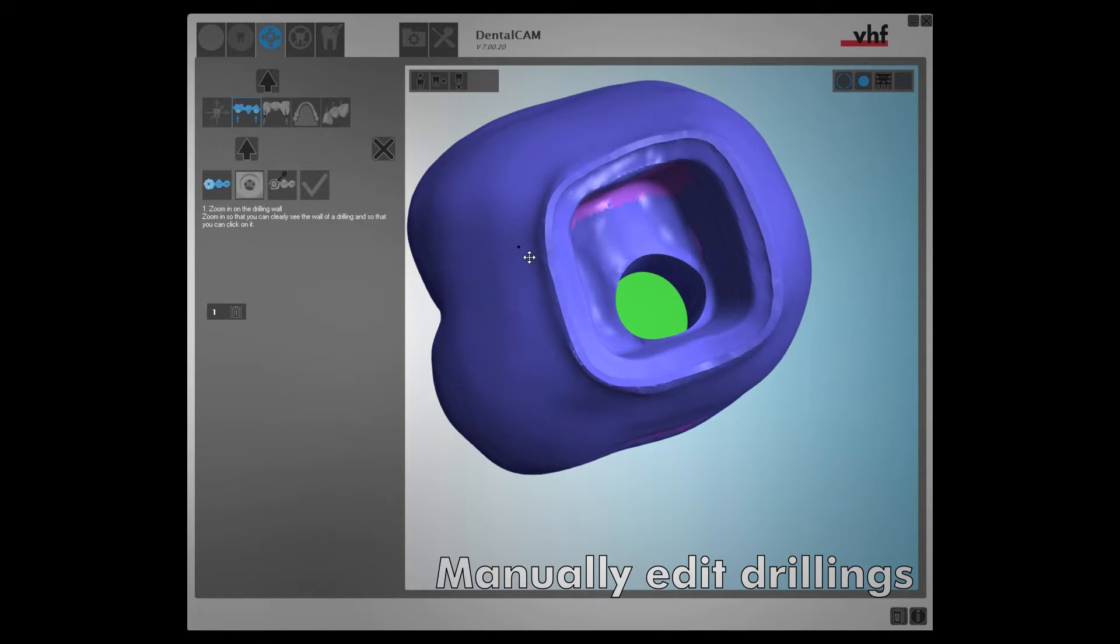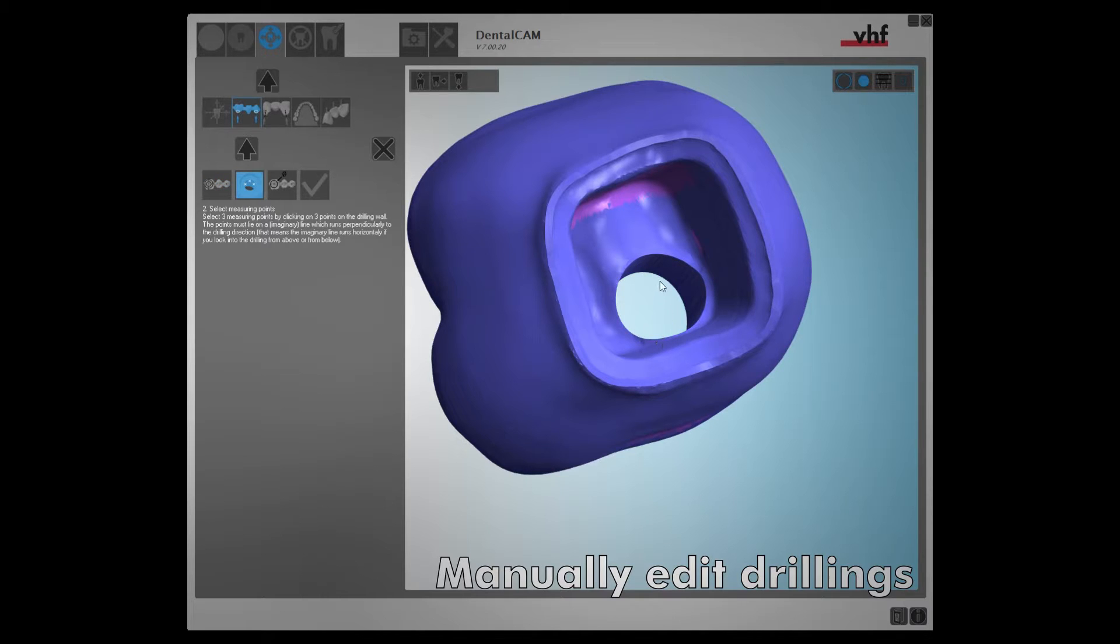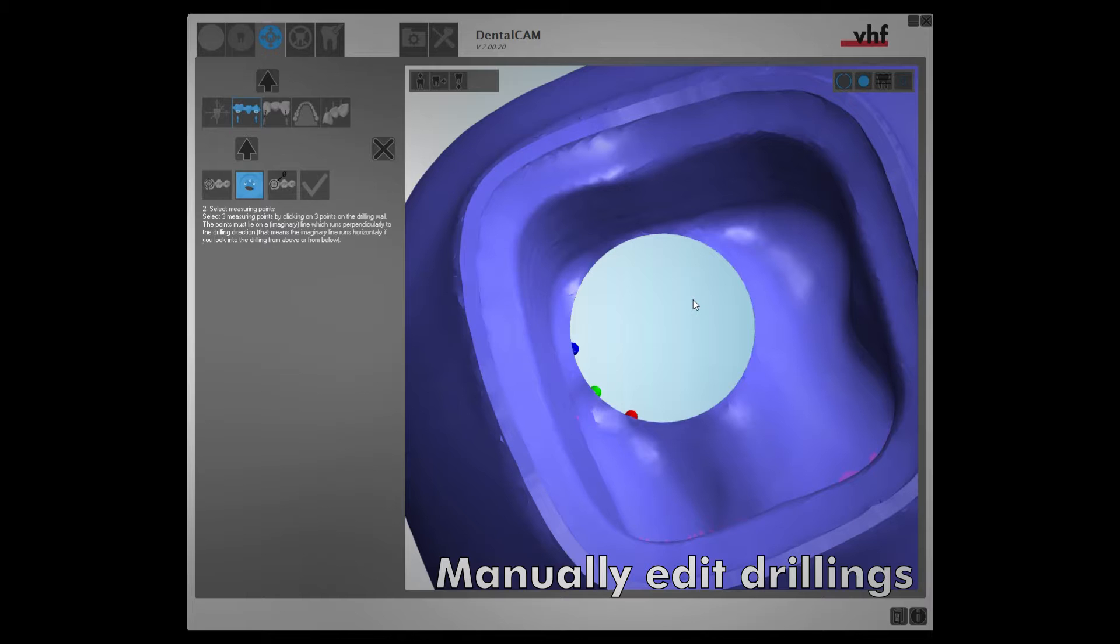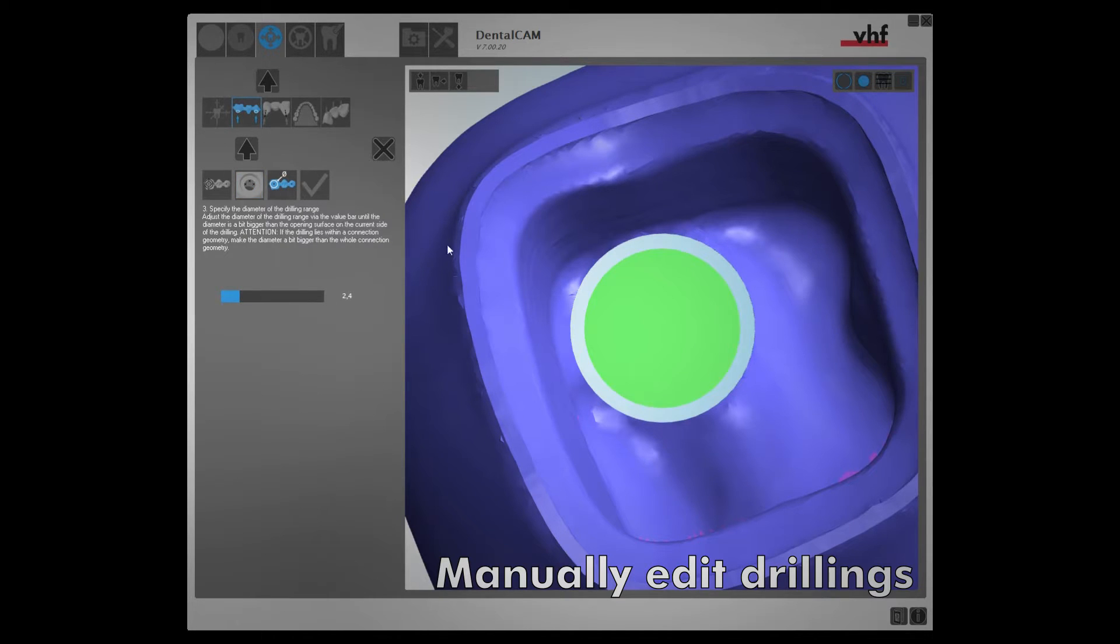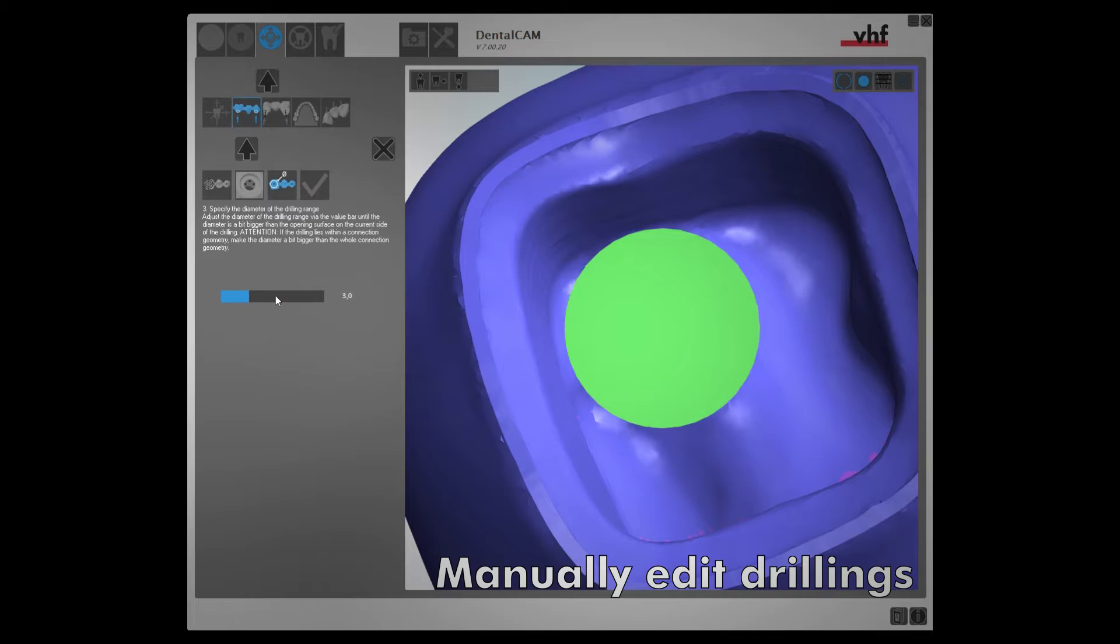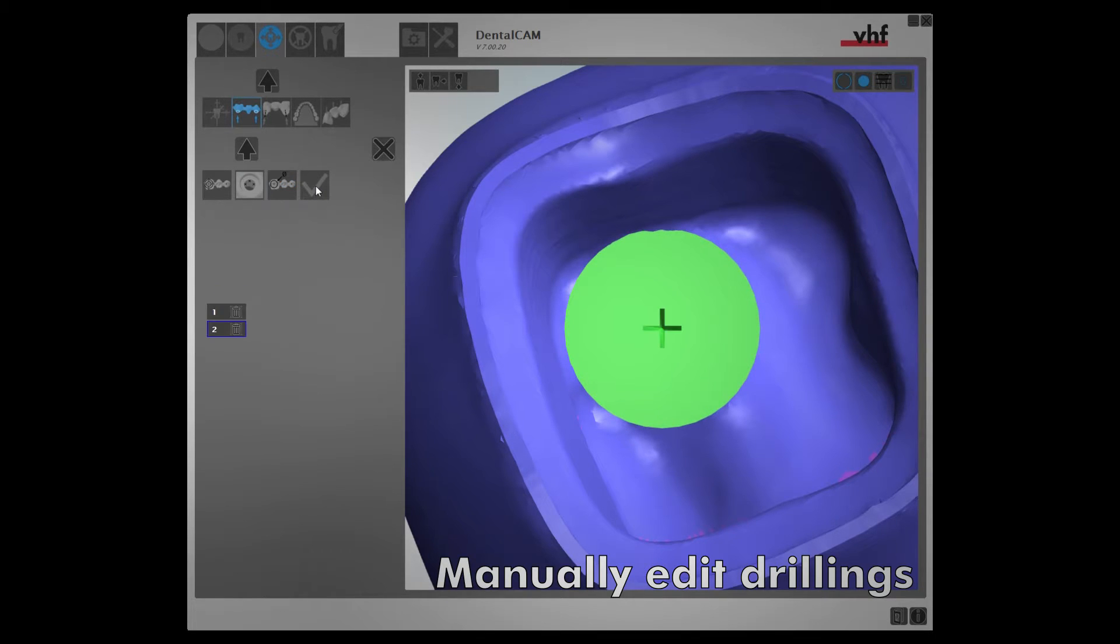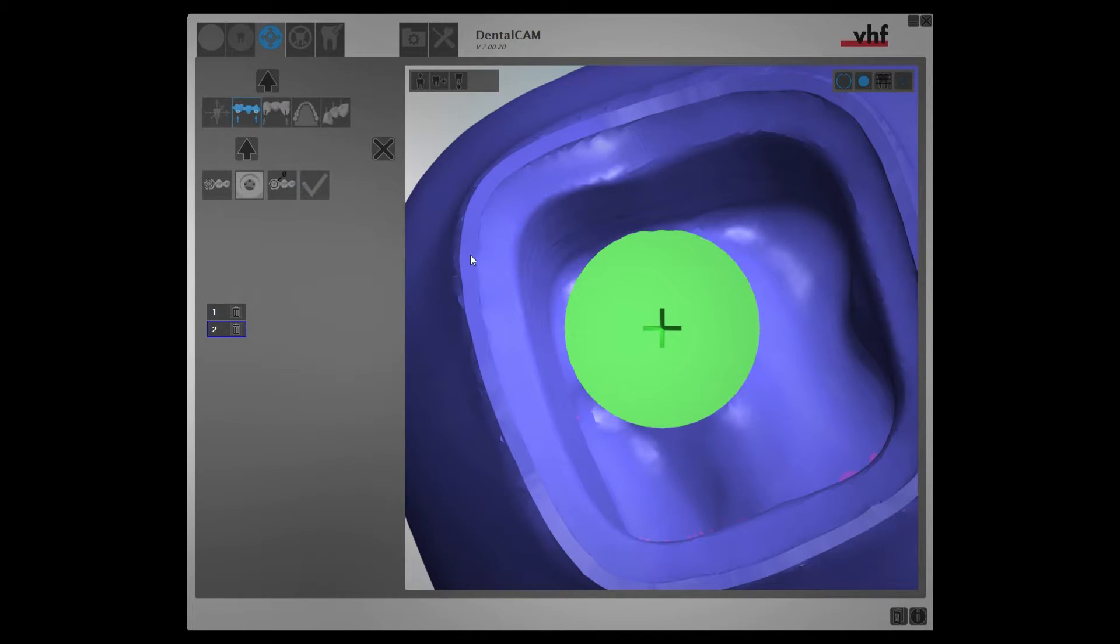Here is an example where we focus on a drilling. Mark the drilling. Specify its diameter. And you're done!